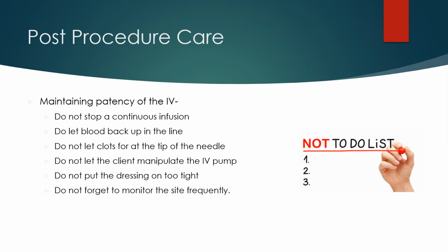Don't let the client manipulate the IV, especially the IV pump. And this can be a tendency. If the pump is beeping frequently, the nurses tend to show the patients how to make that beeping stop. You should never have the patient manipulate the pump or push any buttons without calling you to notify you that it was beeping. Do not put the dressing on too tight.